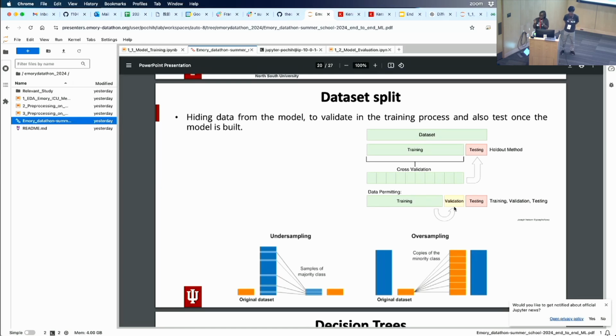So you have to split your data into small batches so that you can load it all the time, but all those will be part of one epoch. When your model has seen everything, that's one epoch, and this is what it learned. We'll see those curves as they come along. But if you don't understand this, you're going to be in a big problem.